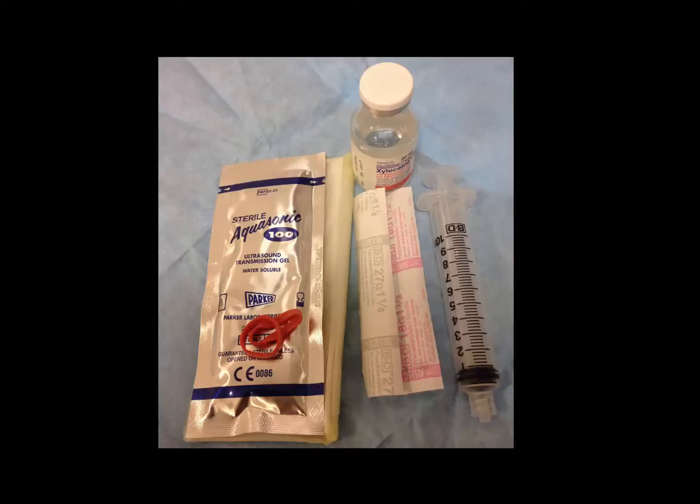In order to perform the block, you will need a 10 ml syringe, 22 to 27 gauge needles — recognizing that a smaller needle is more comfortable for the patient but harder to visualize — an anesthetic such as xylocaine or bupivacaine, sterile ultrasound gel and a probe cover, and something to clean the skin with such as chlorhexidine and gauze.